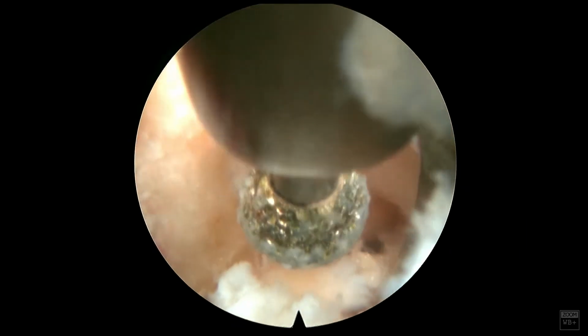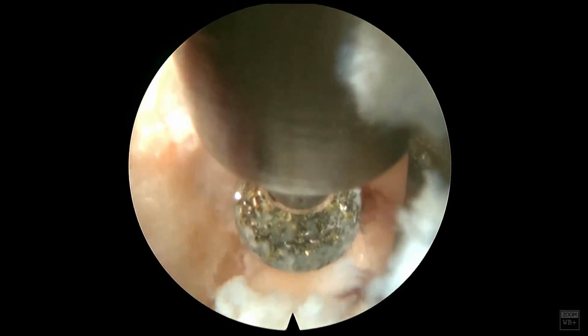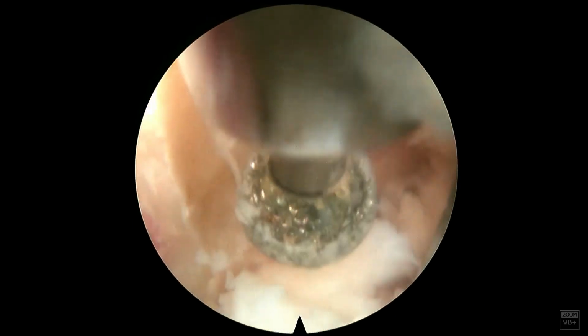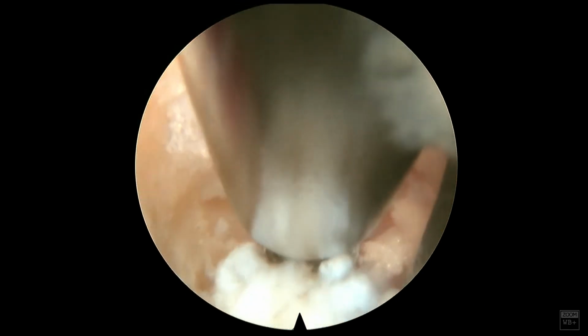As you can see, that may be a nerve on the other side of that. It may also still be a little bit of the ligamentum flavum as the lateral recess comes down. So you want to be careful plunging into that area. I usually use an RF probe to probe the areas to make sure I'm where I need to be. So I always use an RF probe for localization.